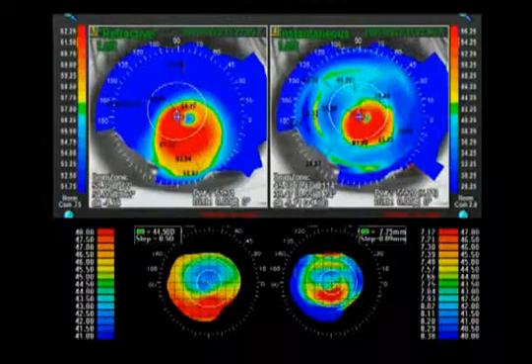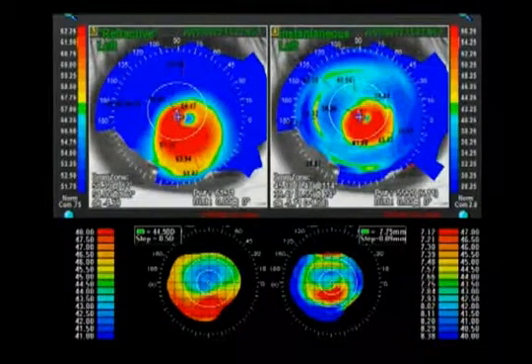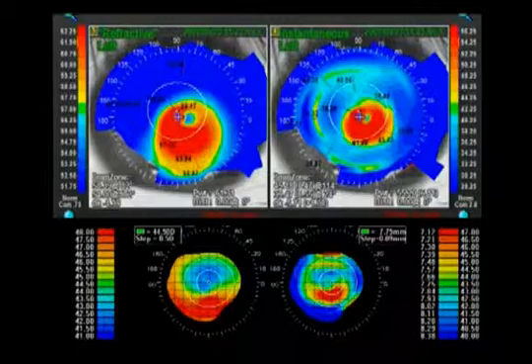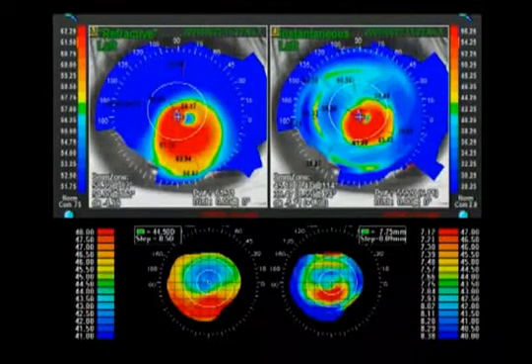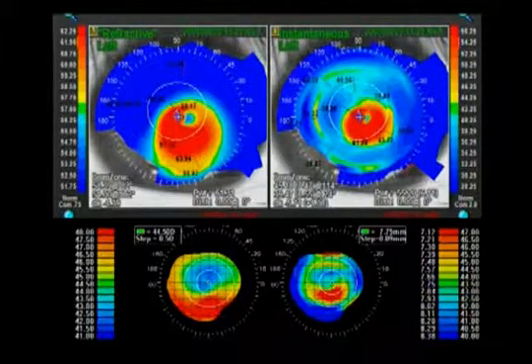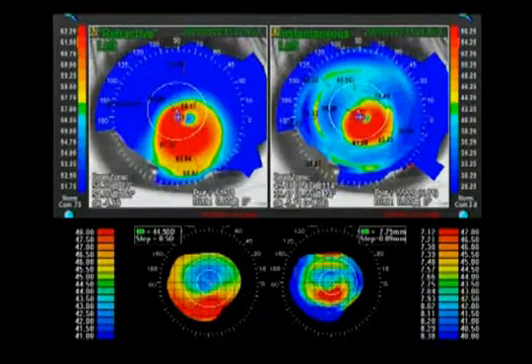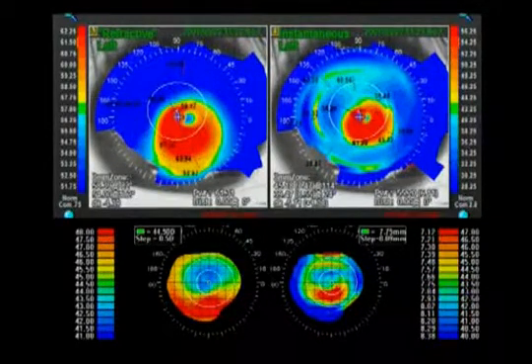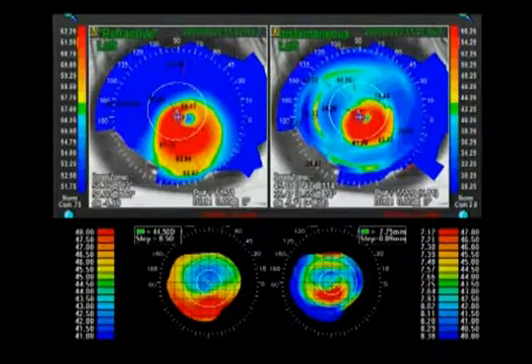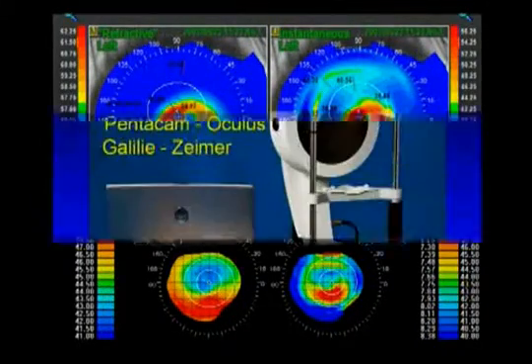Here is an example of that. On the top left is a refractive or axial power map, which you're used to seeing. On the right is a tangential map or local radius of curvature — a more sensitive way of seeing the detail, same data but a better way to look at it. We can actually see the nipple; it's round and not exactly at 6 o'clock. Below, we see the smiley face because the contact lens drops down and pulls the edges up when it comes back up — and it's almost always exactly at 6 o'clock.